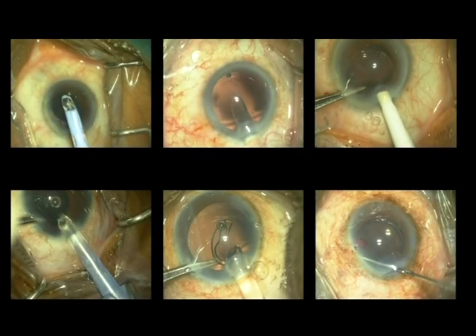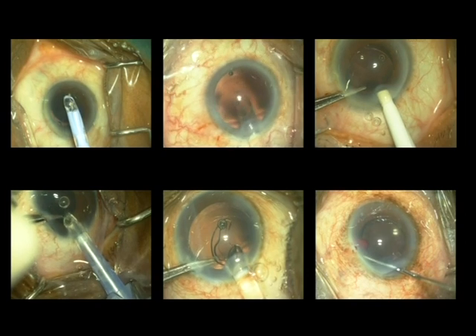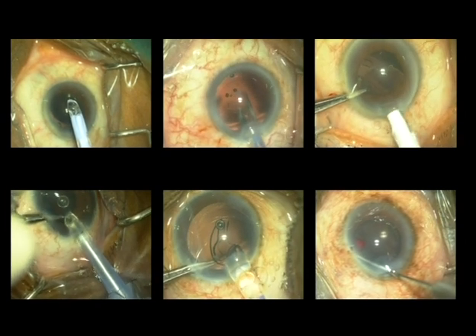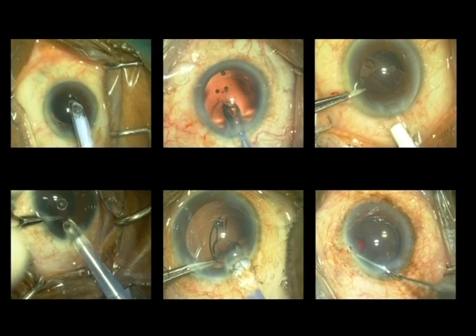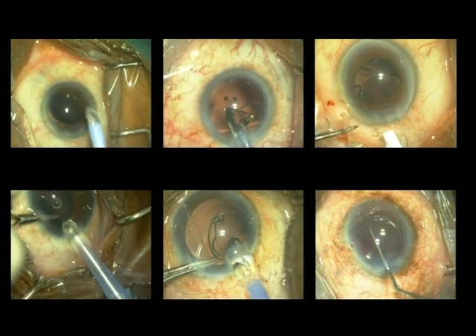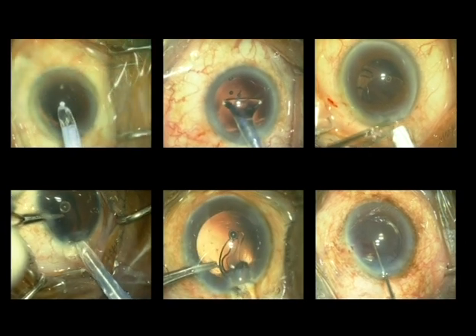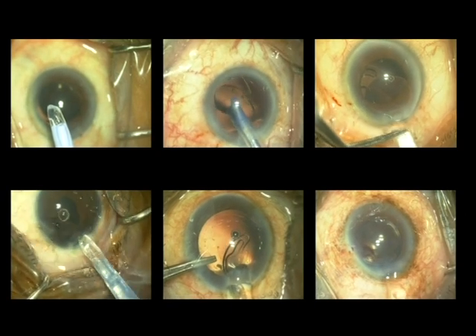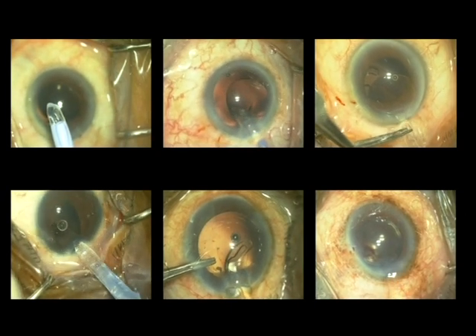A complication related to an intraocular lens may mark the post-operative outcome of a meticulously performed phacoemulsification. Hence, we need to be aware of these complications and how to manage them in order to optimize the eventual post-operative outcome. In this video, we are going to share with you a portfolio of complications having the genesis from intraocular lenses.